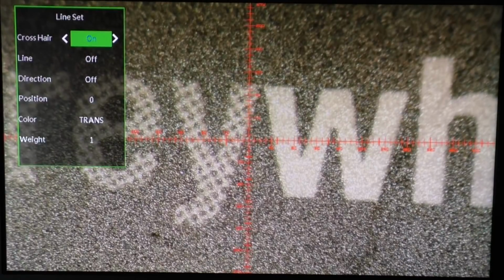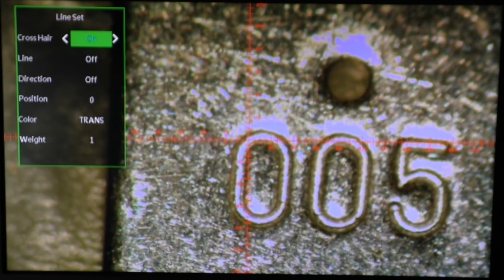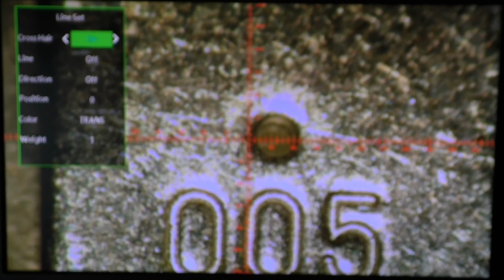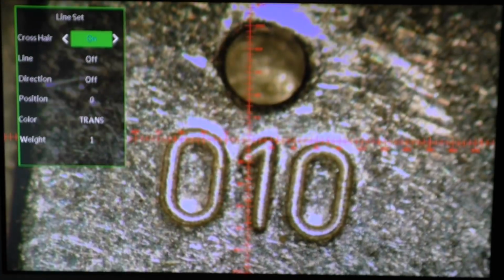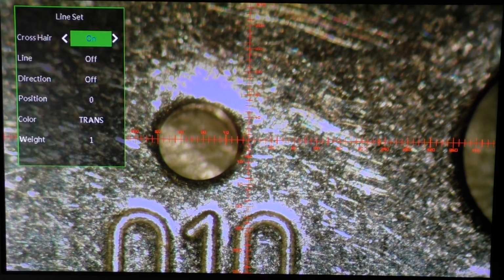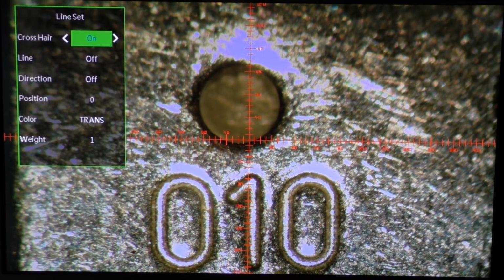But here, well, let me see. So that's, for example, a 0.5 millimeter hole, and 0.5 millimeter in this setup here is about difficult to position. Yeah, it's 80, whatever. So no, 9, so that's 1 millimeter, and that is 160, yeah, a little bit less. Okay, whatever. So we have a crosshair, we cannot change the numbers. Maybe we can change it if we use the right software, but since I have a Mac, there is certainly no software around for that. So I turn that off.